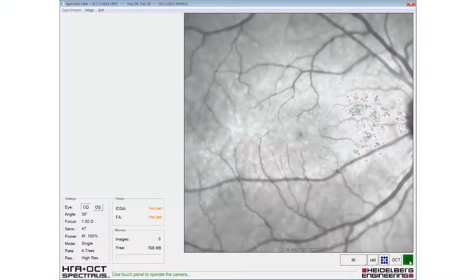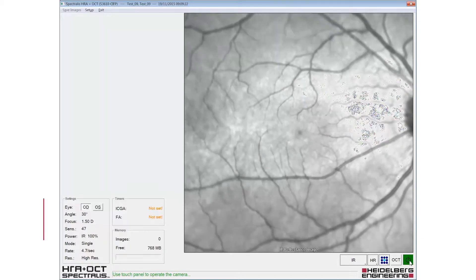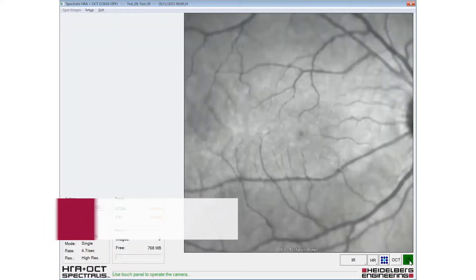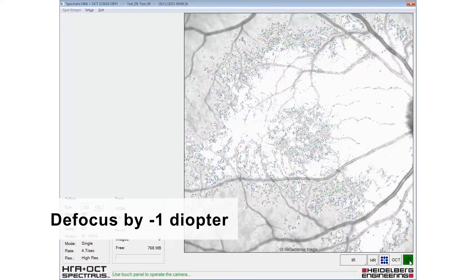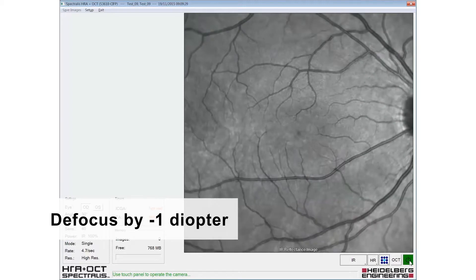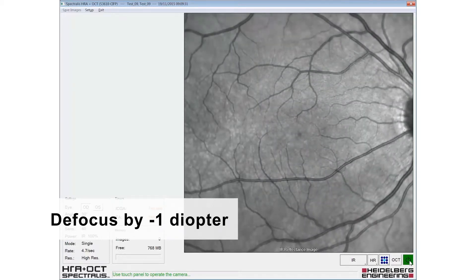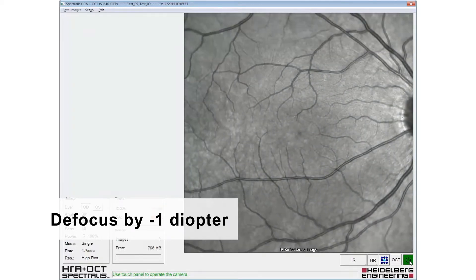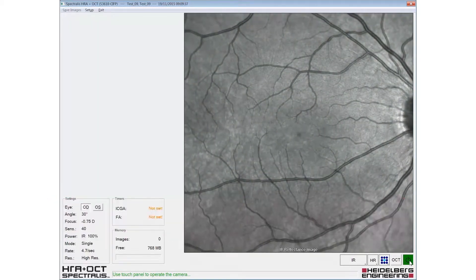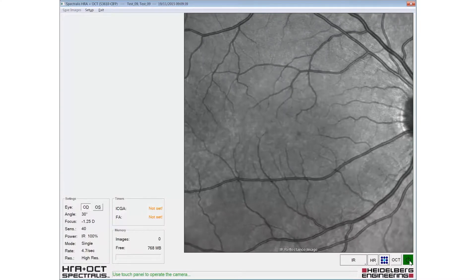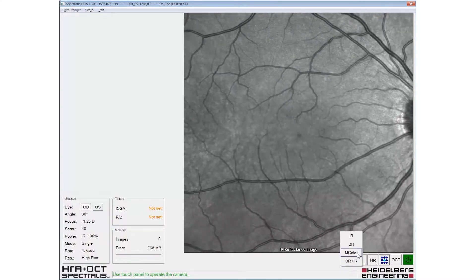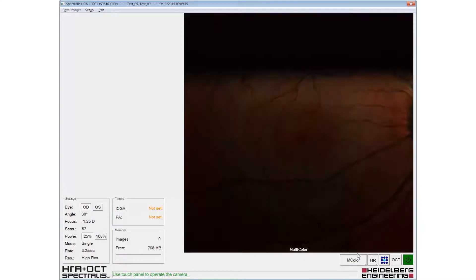The image should be adjusted for sharp focus in IR mode, and a minus one dial up to defocus applied before selecting multicolour. The multicolour modality is then selected from the pop-up menu.